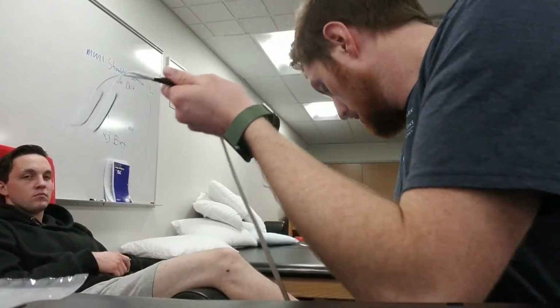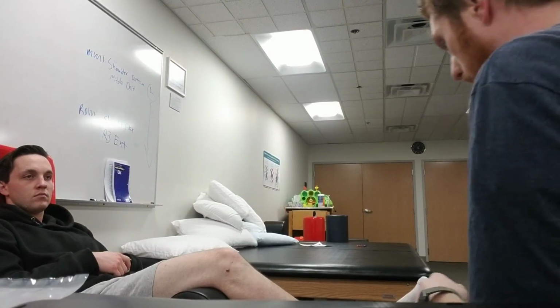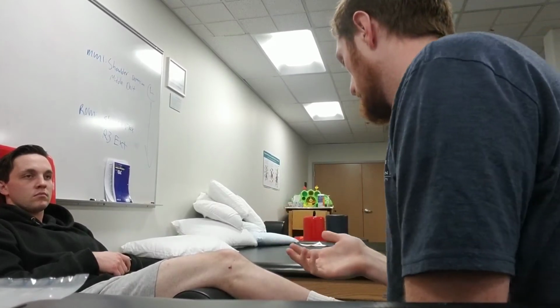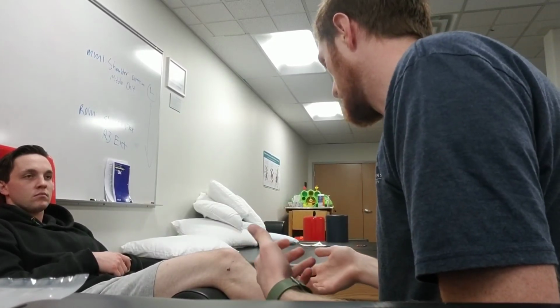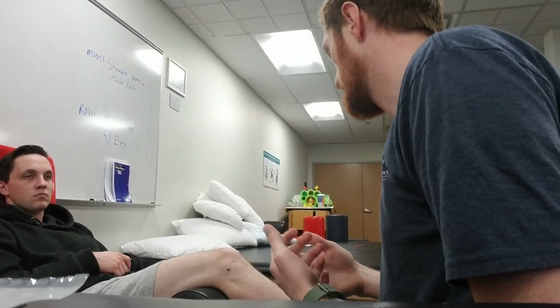And like I said, we're gonna keep these pads just for you to use next time. And hopefully, as we use this, your knee pain will improve after each therapy session, so you won't need as much, hopefully. Okay, and then if you continue to have pain throughout the day, you let me know after our future therapy sessions if that continues to become a problem.